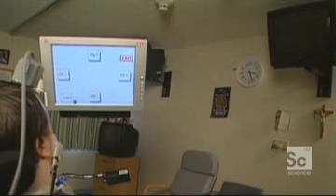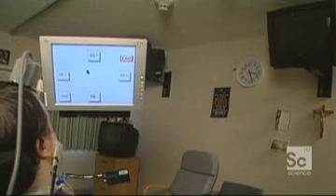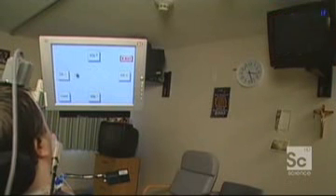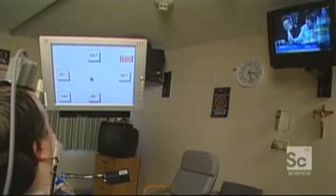Next, I'm going to turn on my television. I'm going to hit power button to turn the television on. The television is on. I'm going to channel down. There's channel down. Now I'm going to channel up.